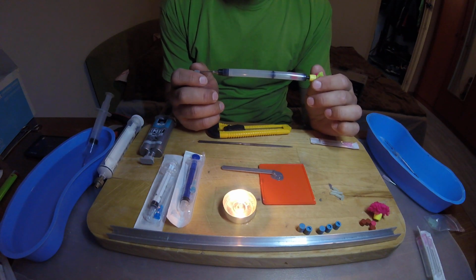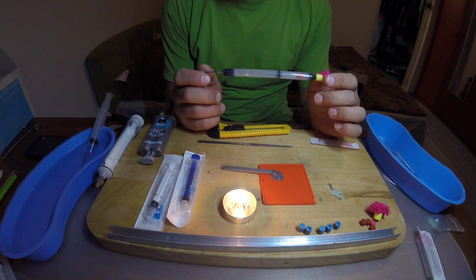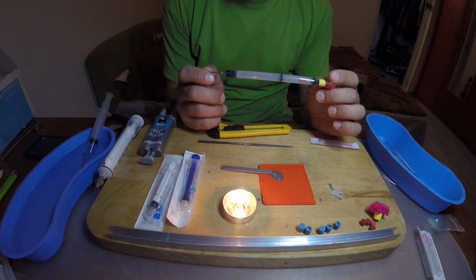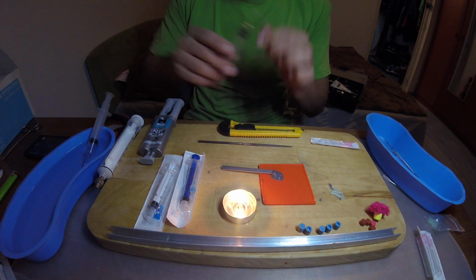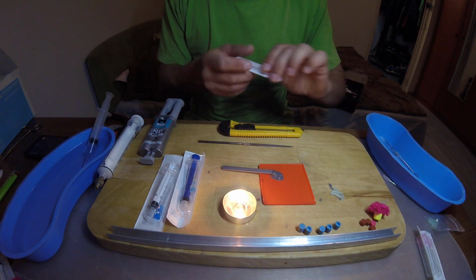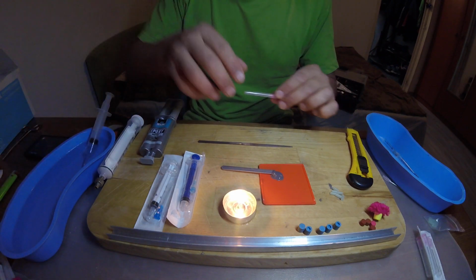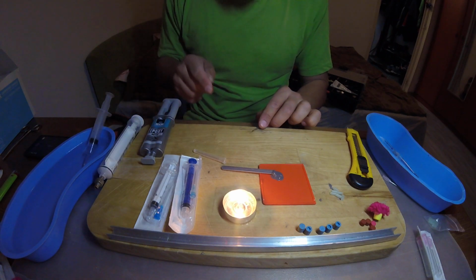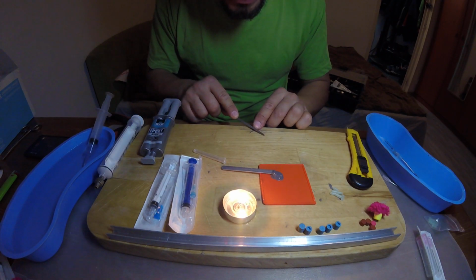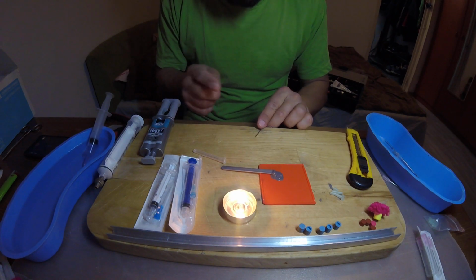Pretty much what we want to do is to build tranquilization darts from materials that we can afford without any problems. So what we are going to do is to first of all build the needle, for which we use a normal 18-gauge needle, the pink one, that we will first have to cut a hole in, just 1 centimeter from the tip of the needle, with a triangular file.